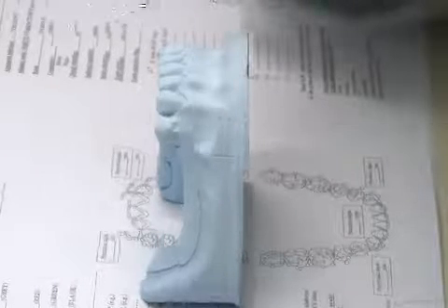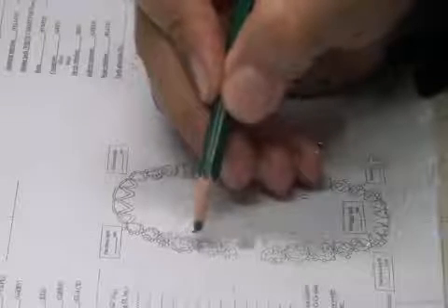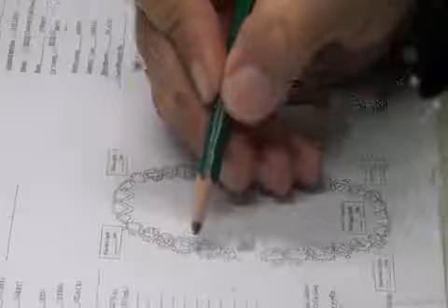So when I want to fill in, the design form has empty circles. Can you see the empty circles around the teeth? These empty circles around the teeth are to tell you where my suitable undercut is. So after surveying, wherever you find your undercut, put a mark on it. You fill in the circle, saying that my suitable undercut is here, on this tooth. This is how we fill in the undercuts.